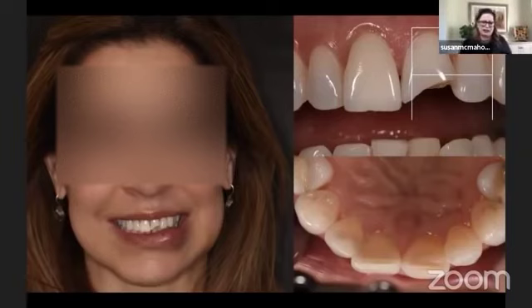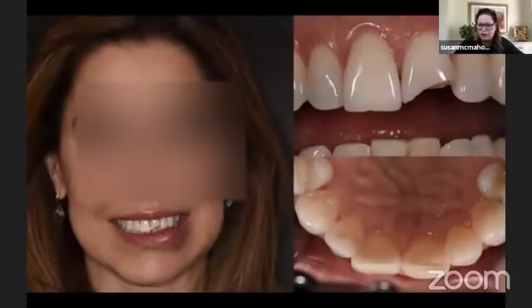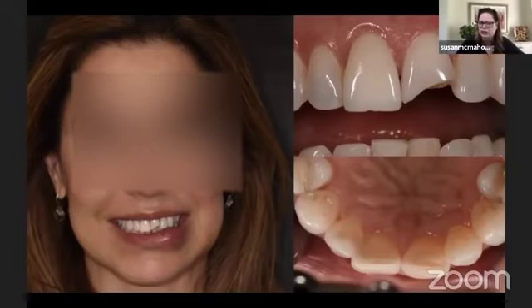You are just a dental hero when you can do that for somebody, right? Just a quick look at her case. When we look at her central incisors, you can see that her number 8 looks brighter than number 9, right? But number 9 matches all of her other teeth. That's something I talk to her about before I start restoring this tooth, because I'm going to restore it to match her other teeth and the way this one was. Number 8's always going to have that little bit of brightness.